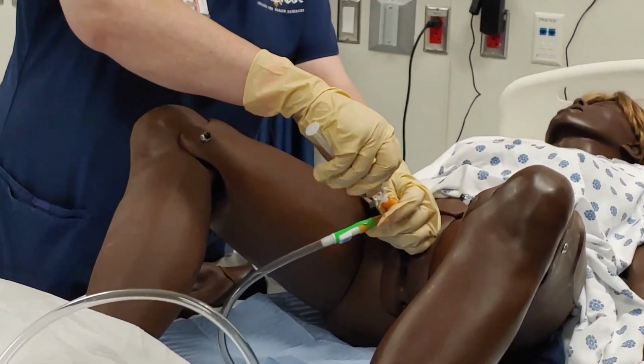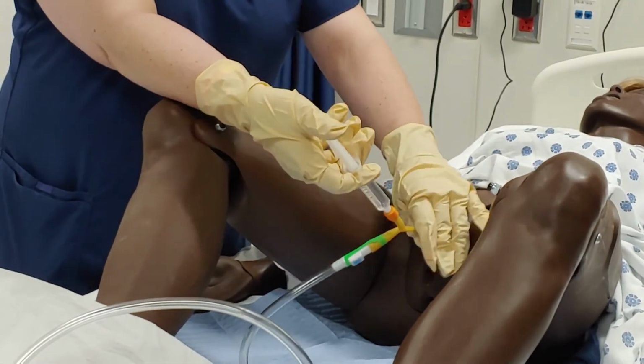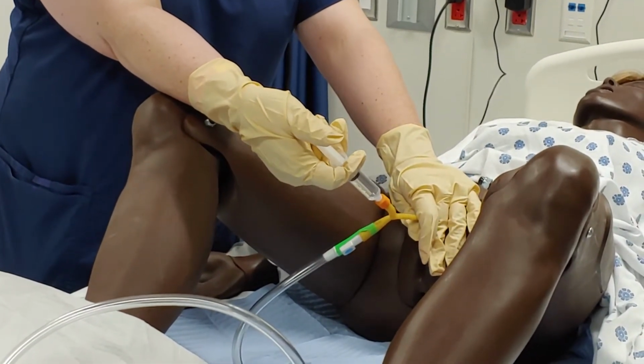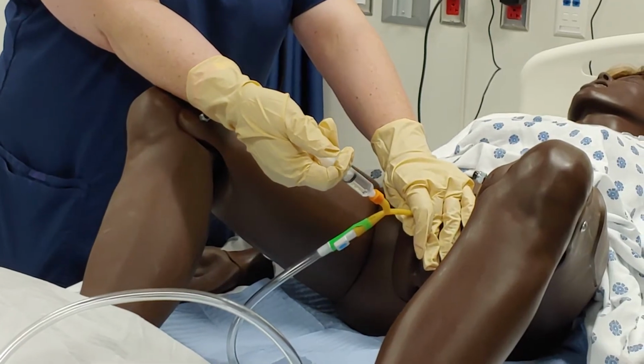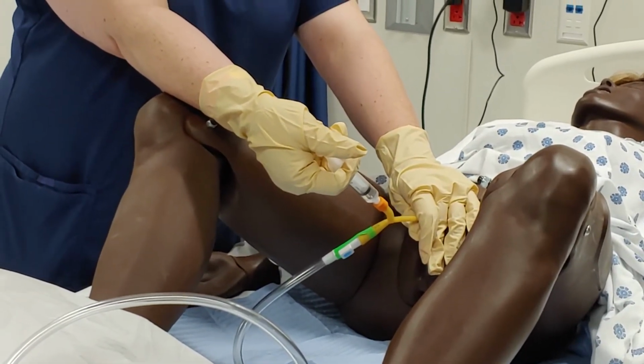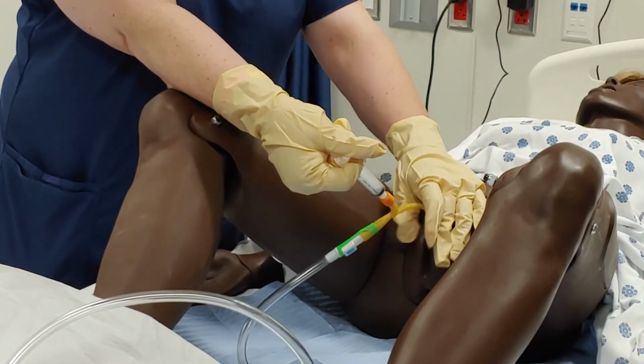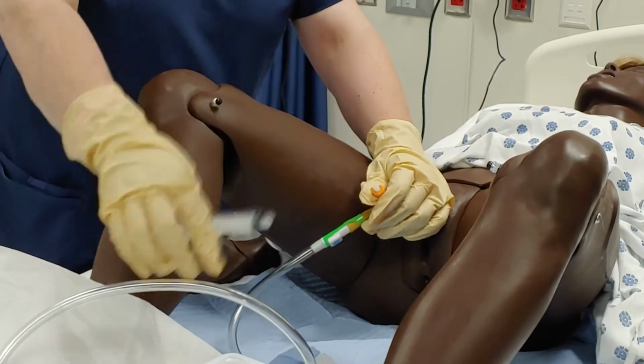Once I attach it, I'm going to squeeze all of that in. Who knows what it's doing? Pushing. It's creating a balloon, and I'll show you what it looks like when I take it back out. Okay? Once I have all that in, I can take it out.